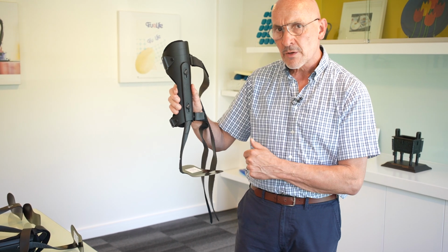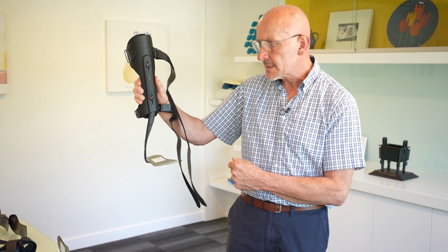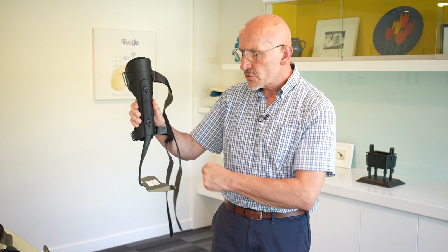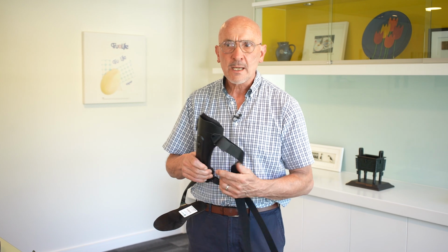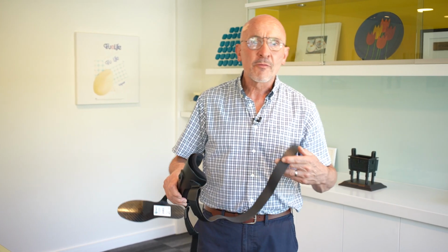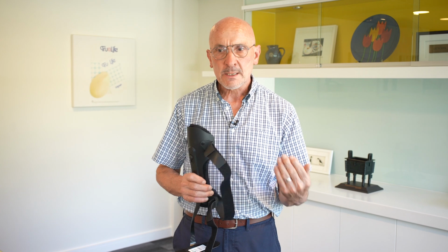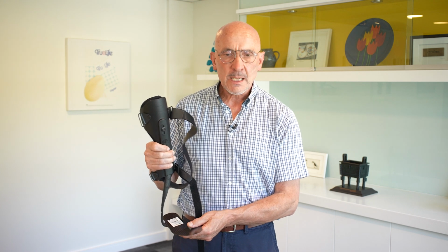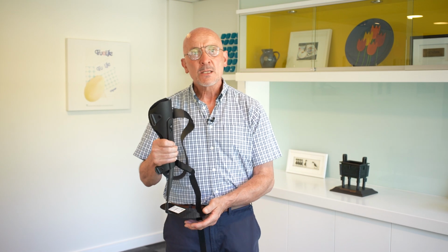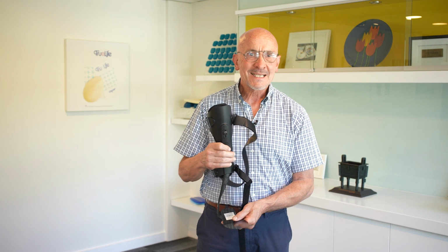The reason for that being that at mid-stance, the carbon strut loads up dynamically with the patient, and on weight transference through mid-stance phase to terminal, the strut releases that energy to give extension thrust to the knee, thereby stabilizing a weak quadriceps situation in the patient, either obvious immediately or upon short-term walking of the patient. The quadriceps weakness can be seen and tested for. The brace will perfectly match and support the patient either unilaterally or bilaterally to improve the gait cycle safety.